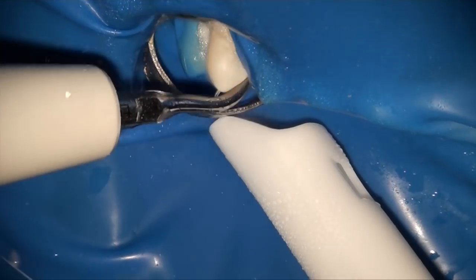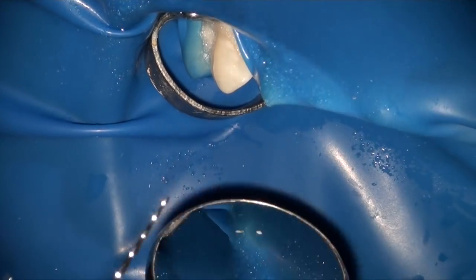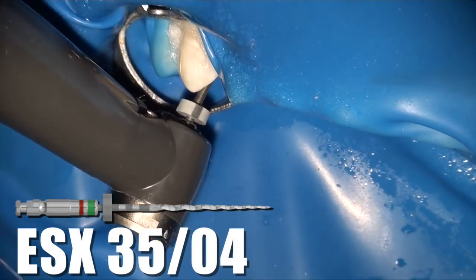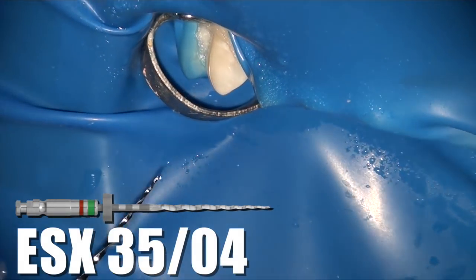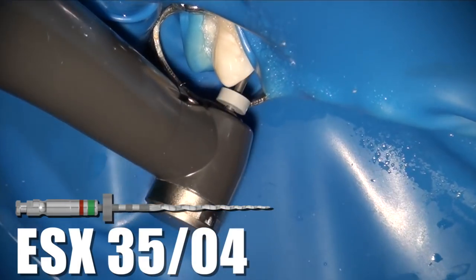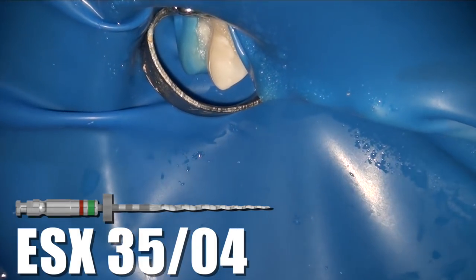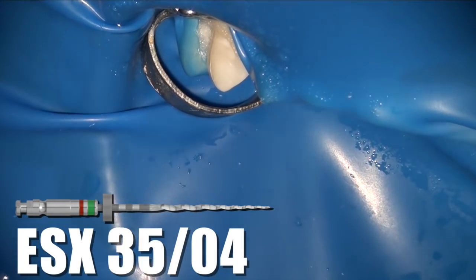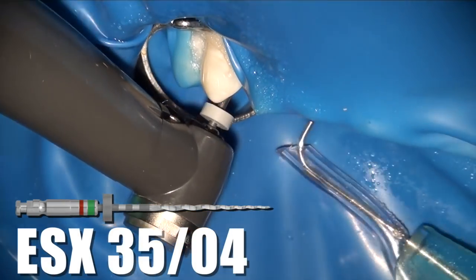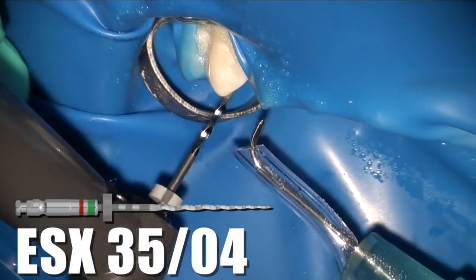Now that we've reached full working length in the buccal canal, it's time to work on the lingual canal and do the exact same thing. We're about four or five millimeters from the apex and by taking these tiny rhythm motion strokes each time the file is grabbing a little bit of dentin and moving its way down the canal. On the third stroke you can see we've reached the full apex on the lingual canal as well.